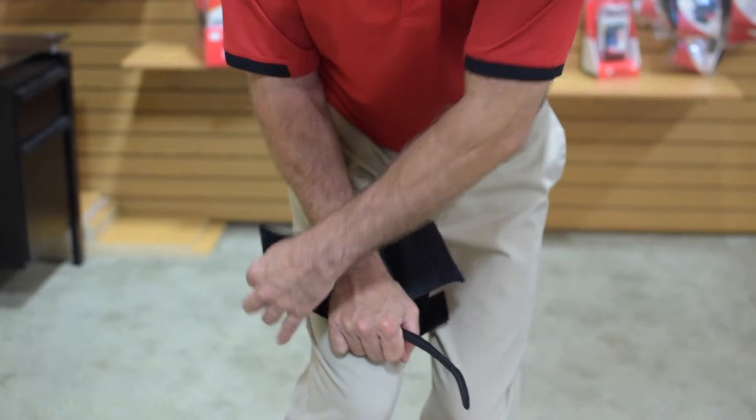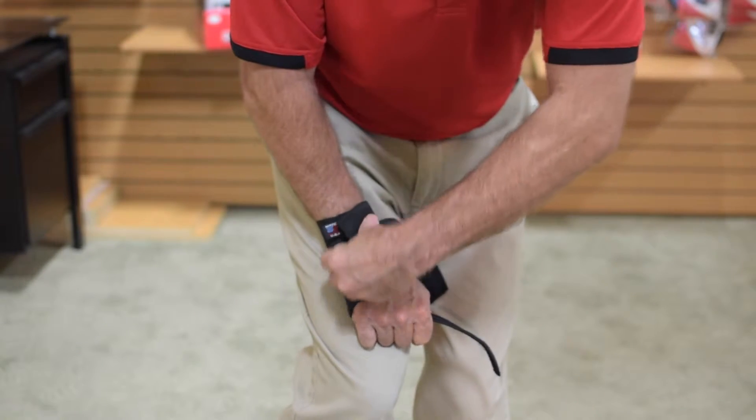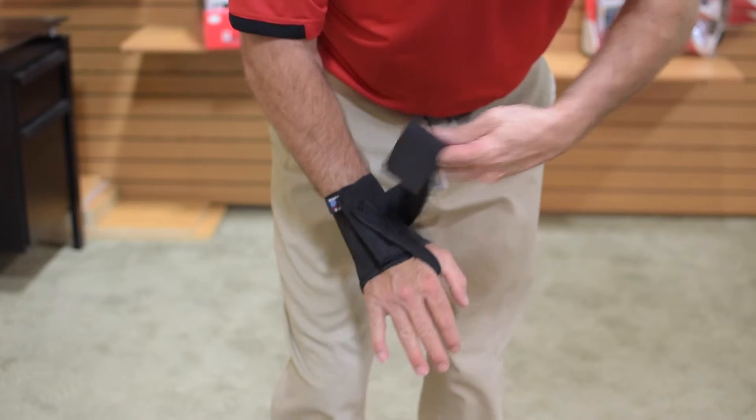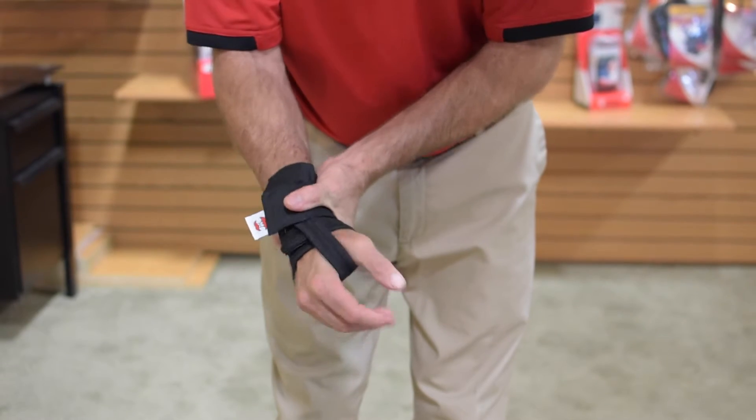The Reflex Wrist Brace features an open palm design with an adjustable thumb strap for comfort. The molded reflex pad eliminates the need for metal stays and helps provide an element of safety when working in electrical situations, while a tension strap provides added compression.